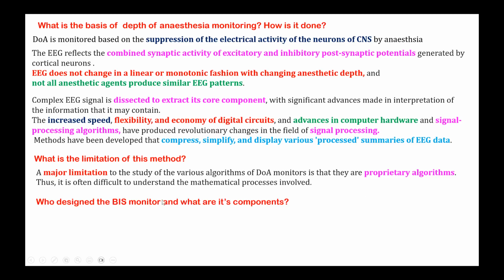And the earliest machine that we started using is the BIS monitor, and it has some components. How many of you have seen or used a BIS monitor so far in your training period? Priya, have you used it? Yes, sir. Can you tell me what the components are? How will you attach it to a patient?